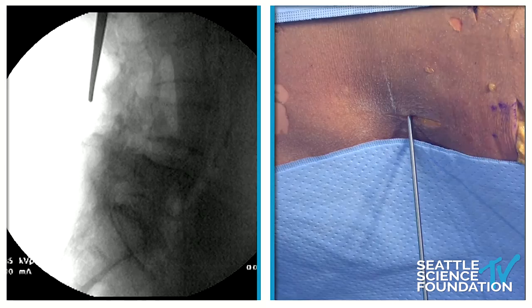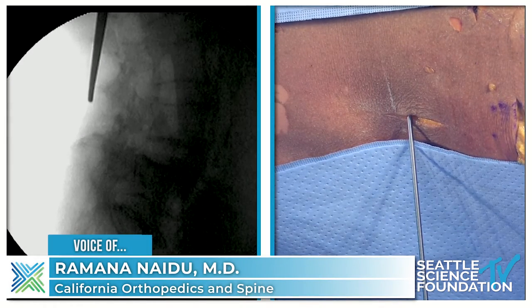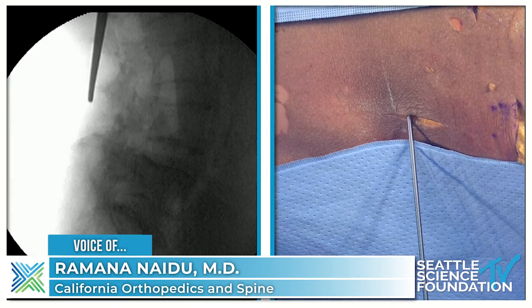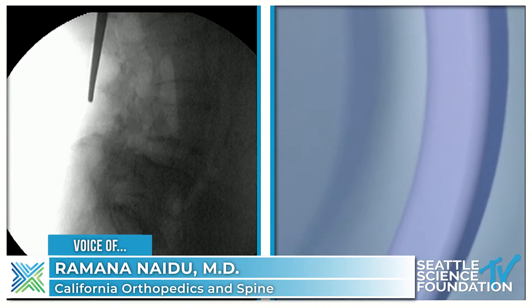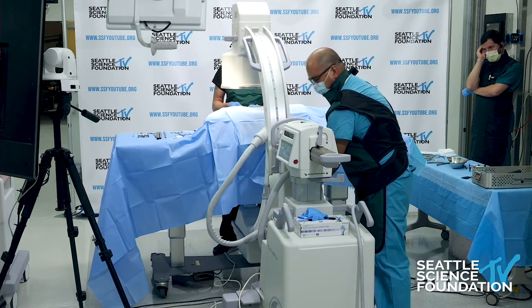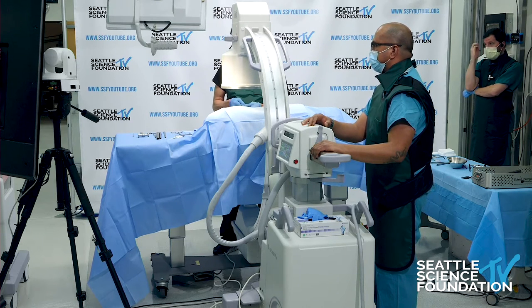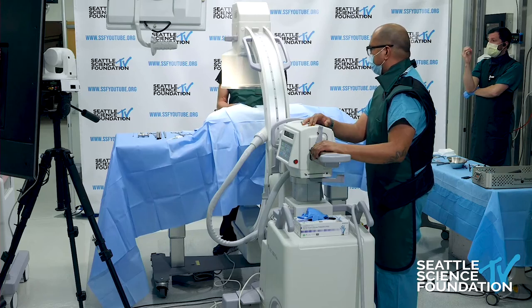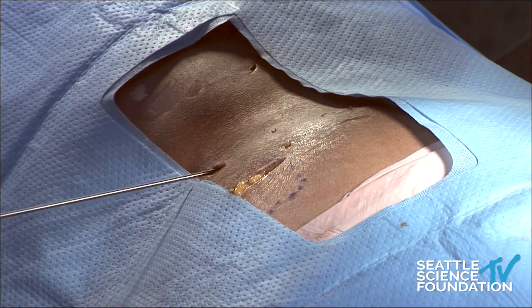Let's come back AP. You can't see the spinous processes as well on your screen as we can on the fluoromonitor, but as you can see, Doug is about a third of the way back from that spinal laminar line or the articular processes. We're going to come back AP and see where we are on a medial-lateral, because you can get hung up on the facet. So we're actually right where we want to be — we're across — and I'm going to send this over to the level of the contralateral pedicle.